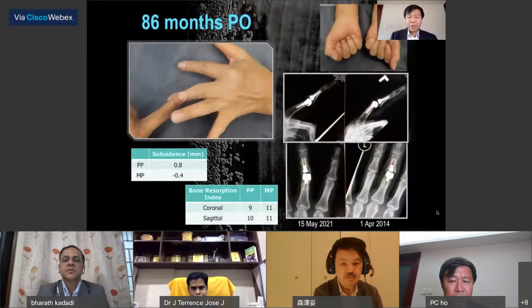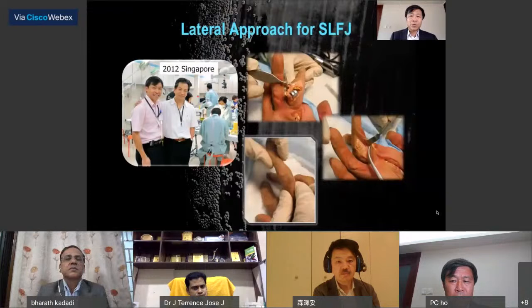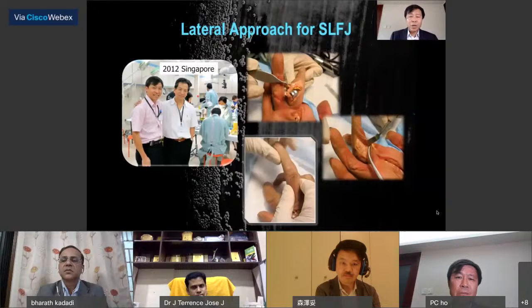The lateral approach is interesting. Actually, I first discussed this with Dr. Minamikawa back in 2012 in Singapore. I believe at that time, we had not yet performed this lateral approach. Actually, we found that in fact, the implant can also be placed into the PIPJ from the lateral side by then flexing the finger. And then afterward, we just repair the collateral ligament, and a very mobile and stable joint can be achieved. Subsequently, we adopted this into our clinical series.